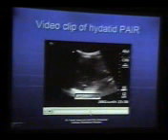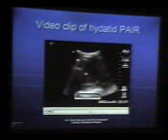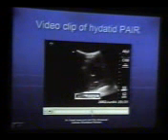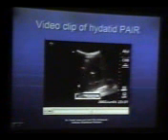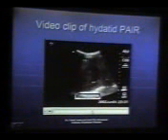Aspiration is under process. Sometimes the membrane and solid contents hinder the aspiration, and then we may have to readjust the needle and suck out the fluid as much as possible.